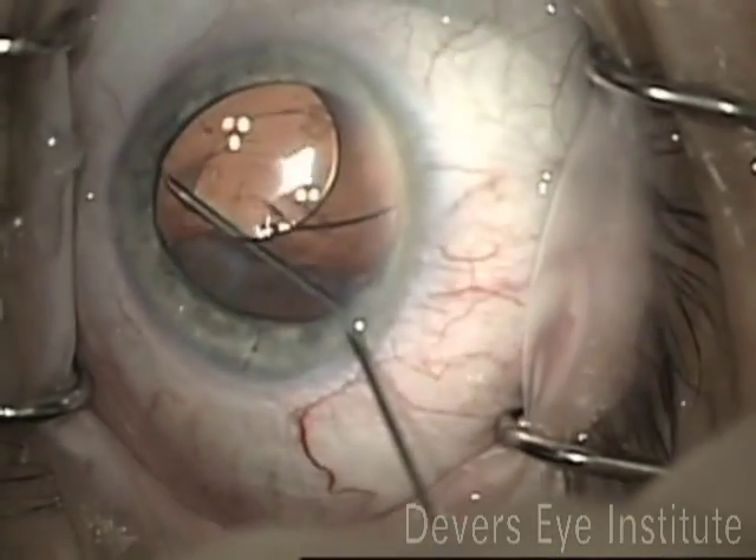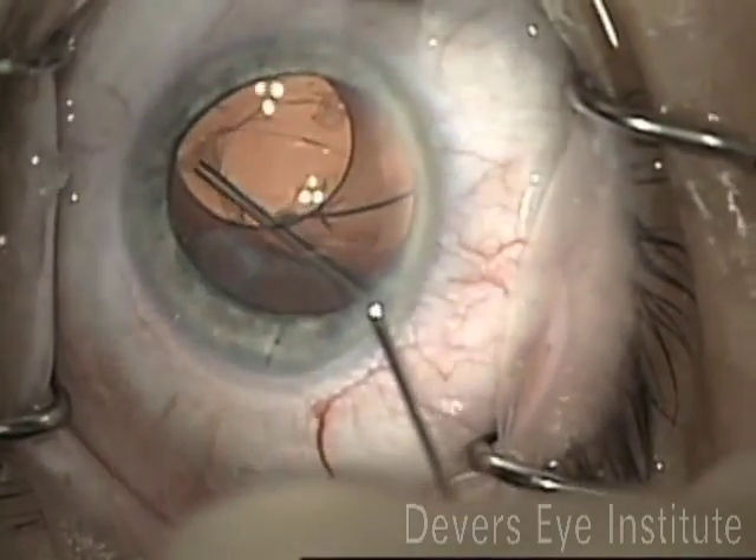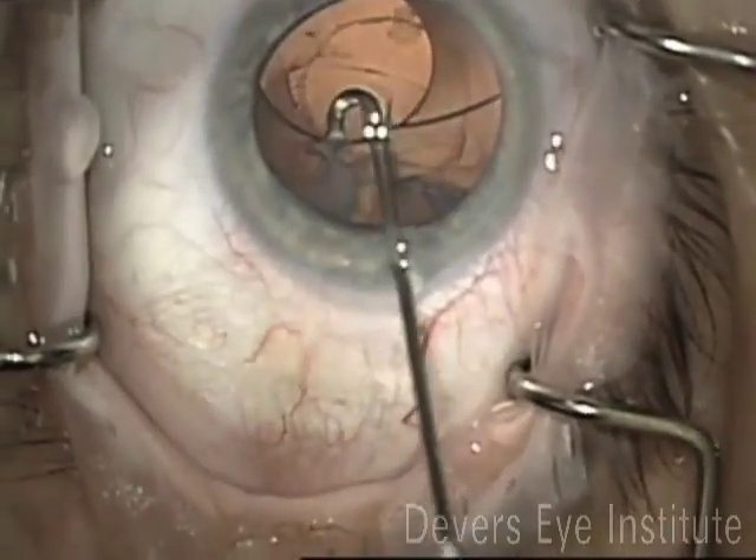At this point, I noticed that one of the haptics was bent, which is probably part of the reason for the decentration of this intraocular lens.